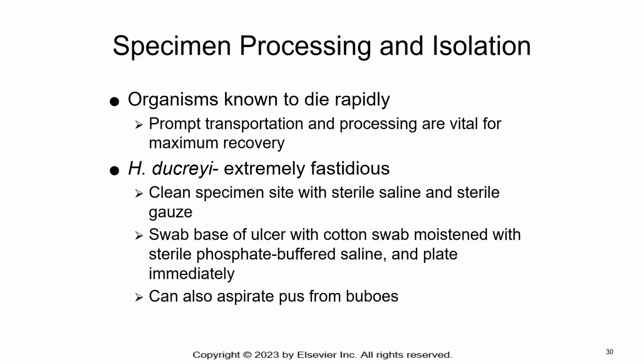Organisms are known to die rapidly, so prompt transportation and processing are vital for maximal recovery. H. ducreyi is extremely fastidious and difficult to grow. Use a clean specimen site, with sterile saline and sterile gauze; swab the base of the ulcer with a moistened cotton swab. You can also aspirate pus from buboes.